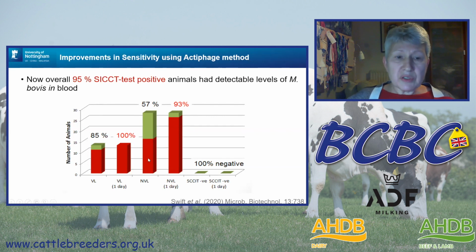So these results here, the ones I showed you on the previous slide, these are the ones using the Actiphage, where 100% of the VL, and I think it was one animal in the NVL group, gave us a negative test result. Now, encouraging again, in our negative test group, doesn't matter the sensitivity here, everything stays negative. So increasing this sensitivity did not decrease specificity. We're still getting this good discrimination between uninfected and infected animals.